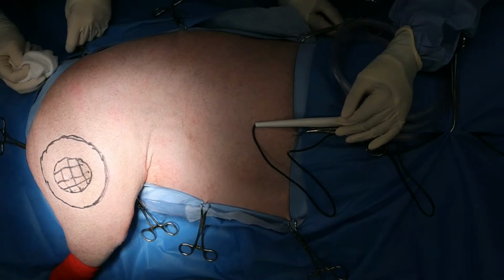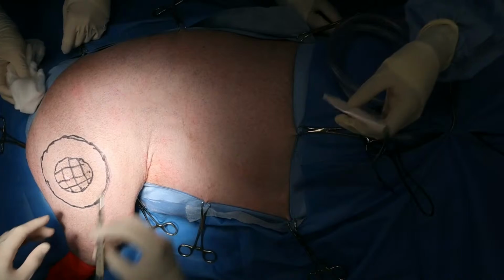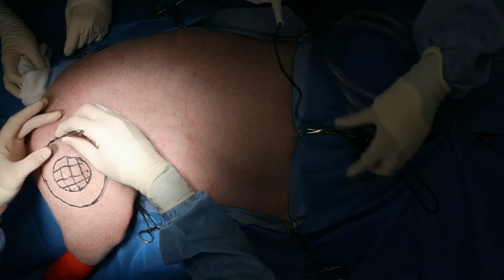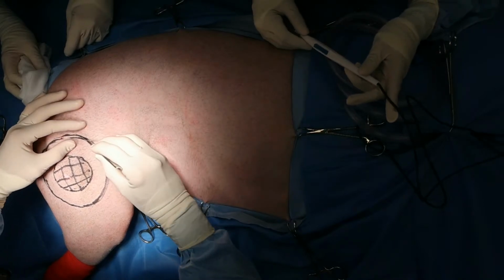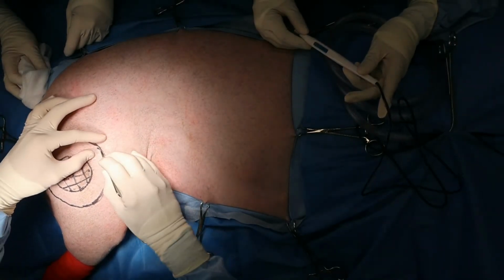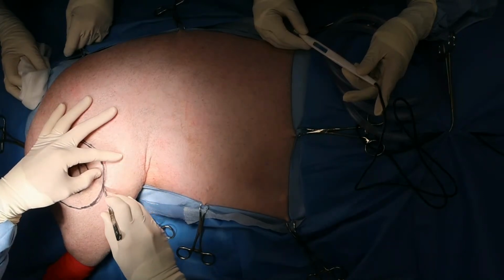And interestingly, on these cases, often we have more complications with the donor site than we do with the recipient site. So we're going to get 3 centimeter margins all the way around on this, and we'll see as we get deeper that we're going to get into the biceps muscle fascia as well as the fascia lata.